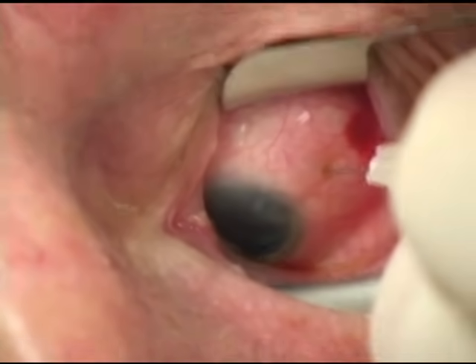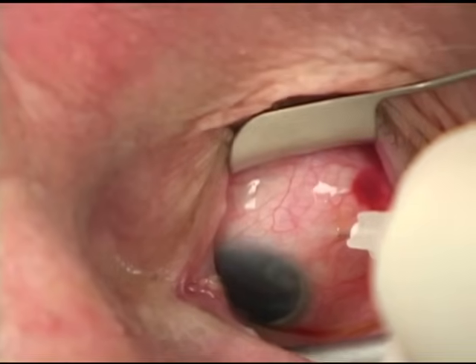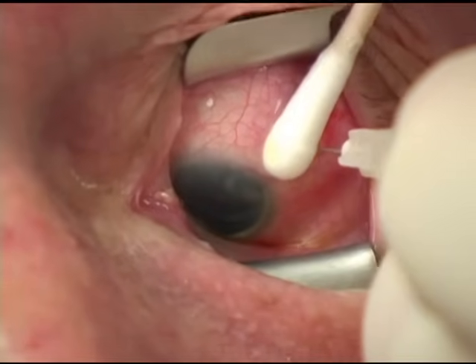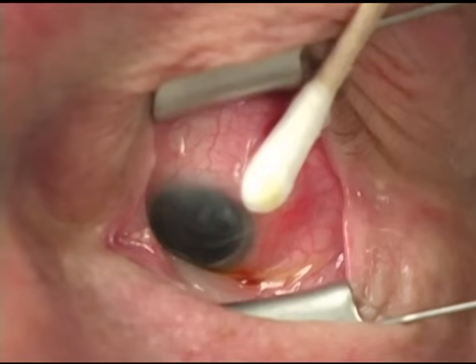The 30 gauge needle is then directed into the middle of the vitreous cavity and the drug is slowly injected. A cotton tip applicator is placed over the injection site to prevent reflux of fluid or medication.